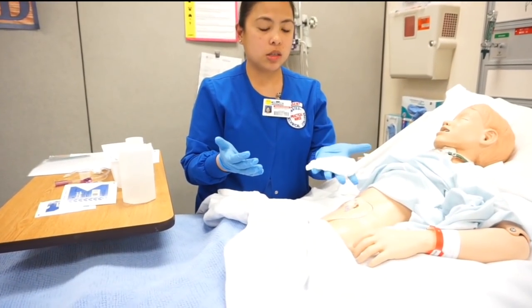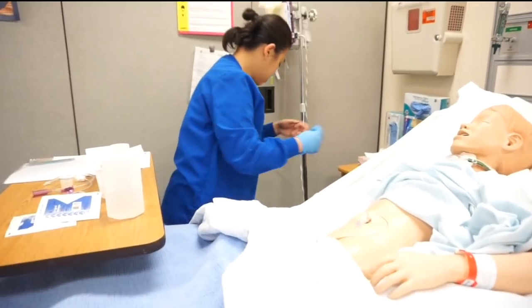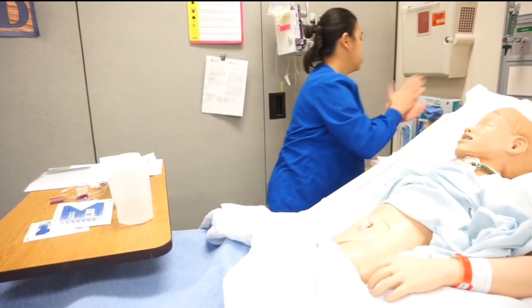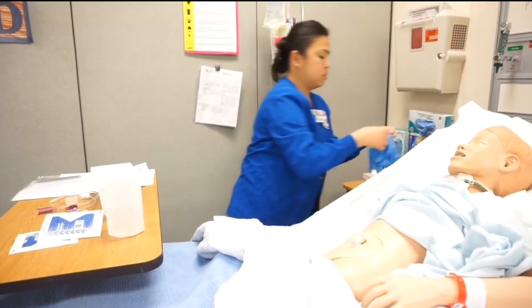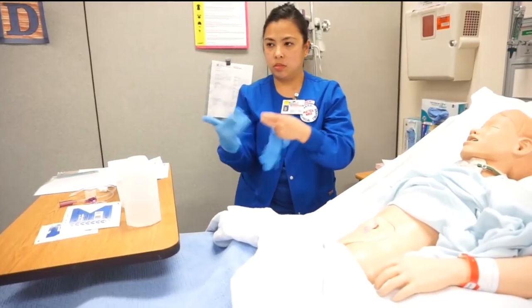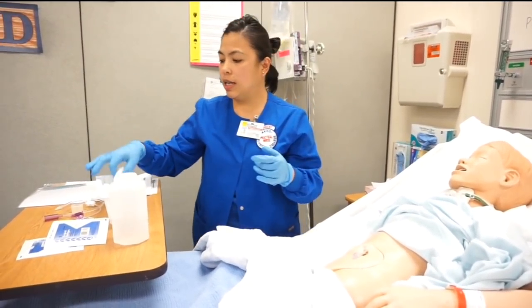After I remove the gauze, I'm going to throw it away in the receptacle. Then I'm going to remove my gloves and don a new pair of gloves. Now I'm going to clean the site — clean the area.